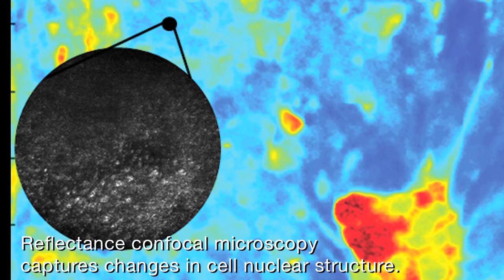After imaging with fluorescence lifetime on the macroscopic scale, we then go in with high resolution with reflectance confocal microscopy. The purpose of the reflectance confocal microscopy is that we're getting information about the subcellular structure. So we're really looking at nuclei, and these nuclei are features that the pathologists are looking at to identify pre-malignancy or malignancy in tissue.